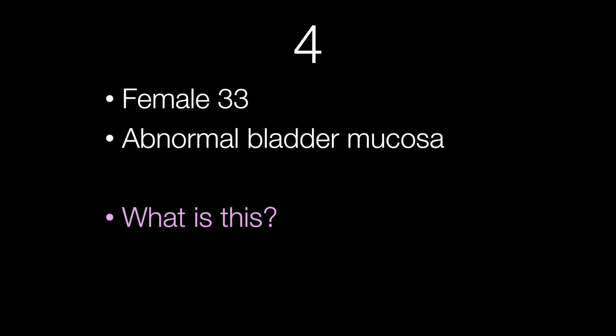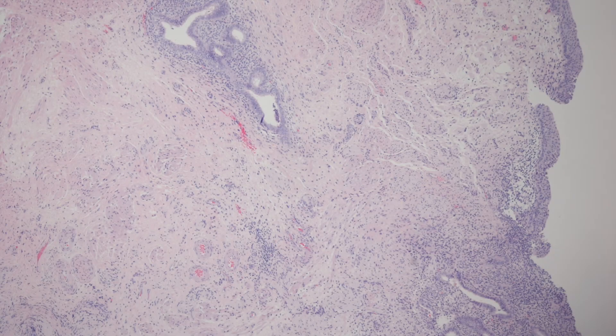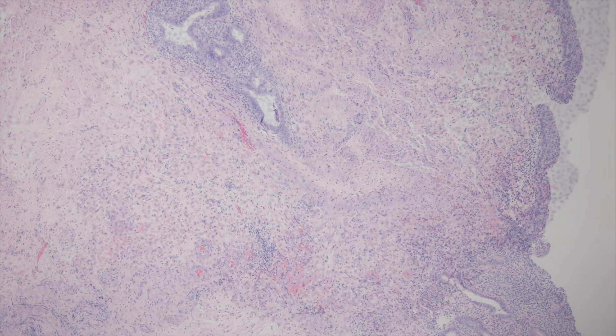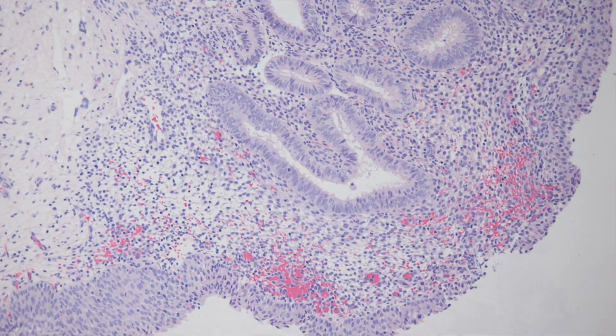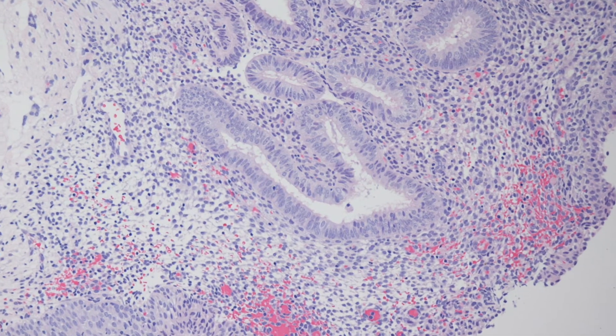The fourth case is from a female of 33 with an abnormal bladder mucosa. What is the abnormality causing the abnormal bladder mucosa? This is a low power view, and here is a higher power view that should clinch the diagnosis.